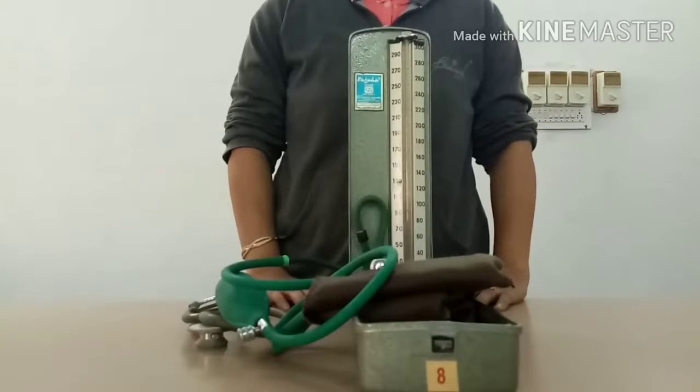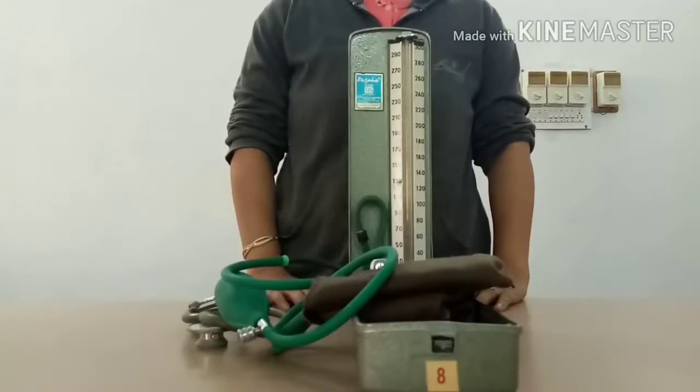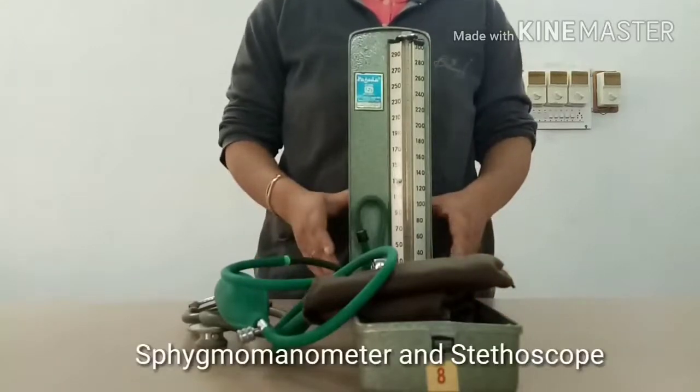Maximum and minimum pressures in the arterial system are known as systolic and diastolic pressures respectively. The instrument commonly used for the measurement of blood pressure is the sphygmomanometer.